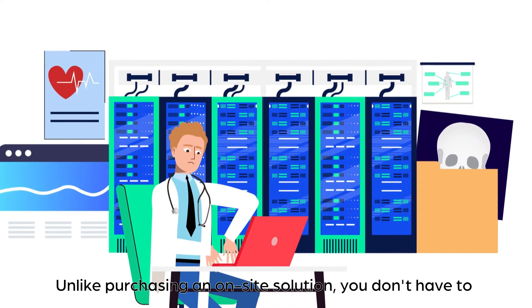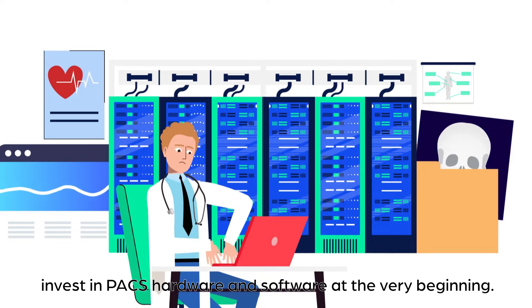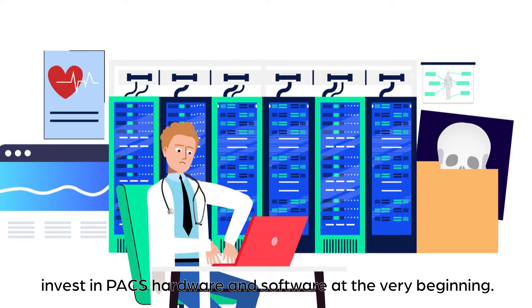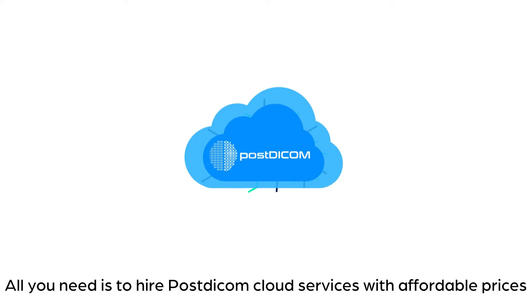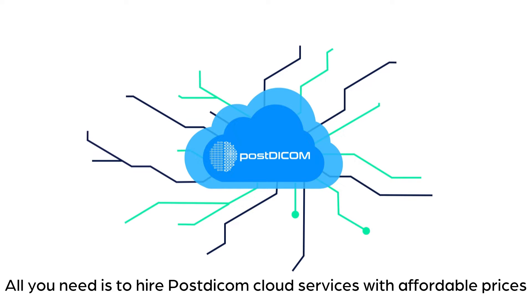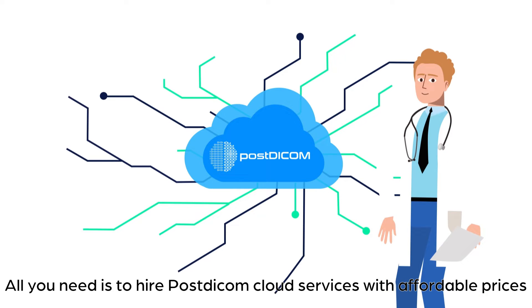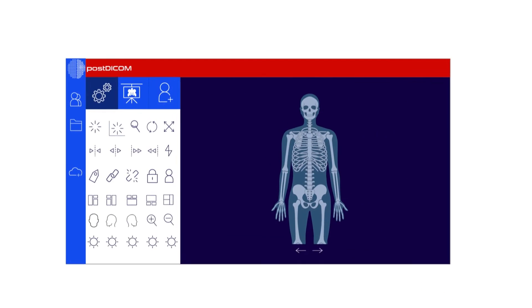Unlike purchasing an on-site solution, you don't have to invest in PACS hardware and software at the very beginning. All you need to do is hire Post DICOM cloud services with affordable prices and scale the solution according to your growing needs.